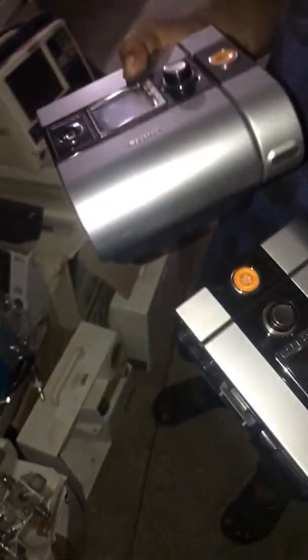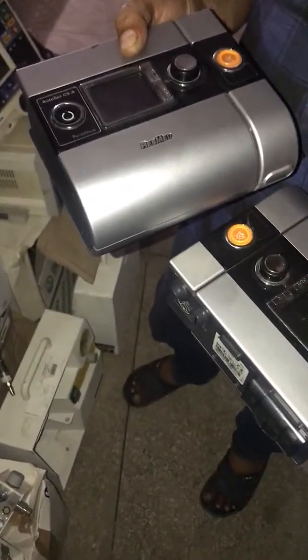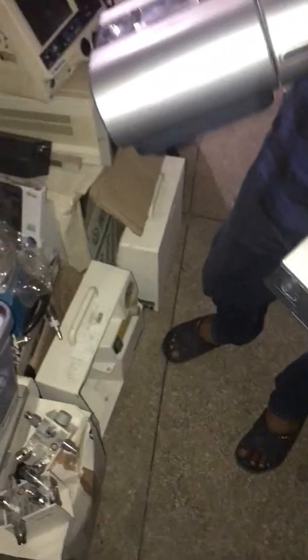What is the price of this? We are selling it for almost 70 to 75 thousand. This is also available in refurbished units. We don't get it new here.